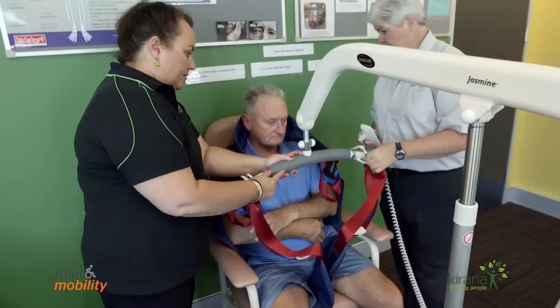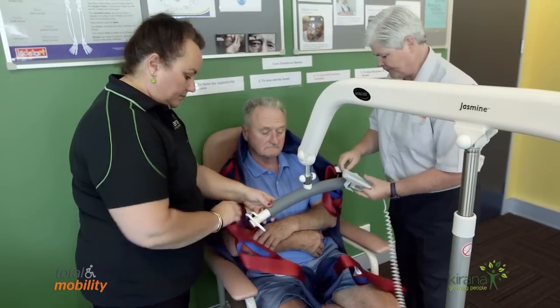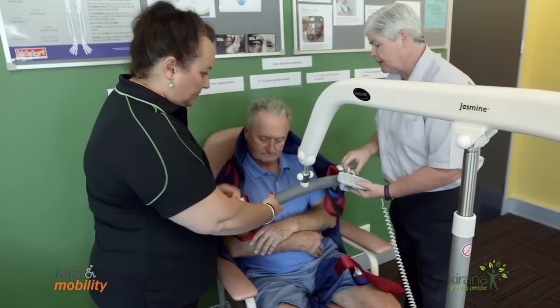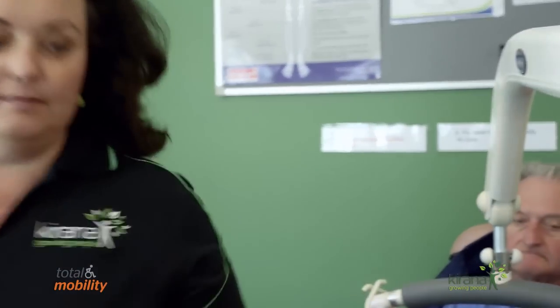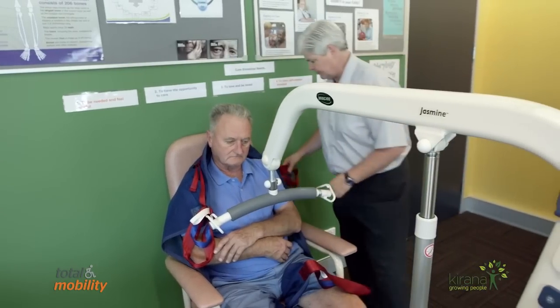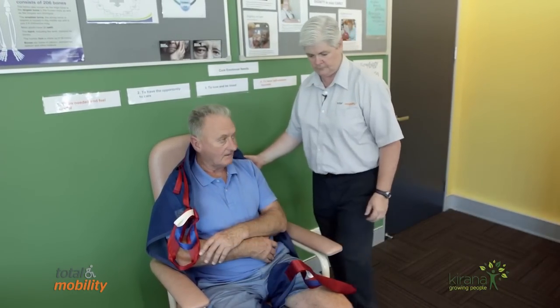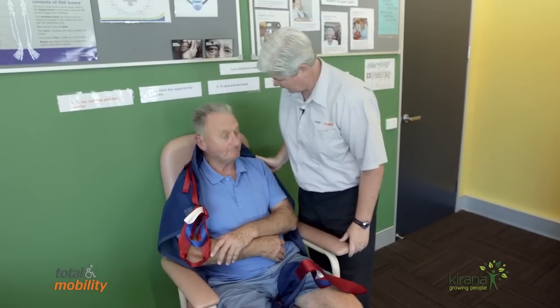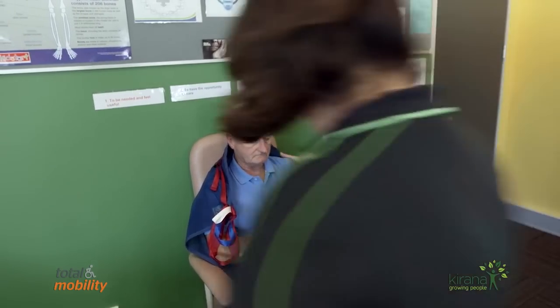How are you sitting there? All right. Just going to remove the loops off the lifter bar, nice and easily. Mr. Williams, I'm just going to move the hoist away now — free and clear. I'll give Melissa the control. Okay? Yep. So we're just going to help remove the sling — Melissa's going to help on her side. Mr. Williams, we're now going to remove the sling from your back. To do that we need to take the leg straps out.